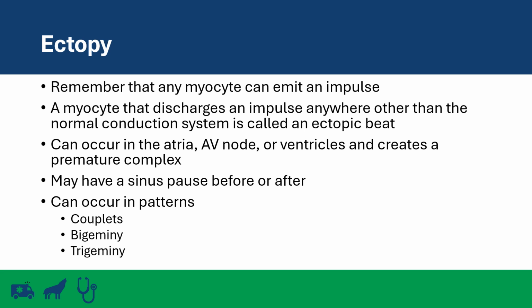Now, there may be a little pause in the baseline. You may have a sinus pause before or after this impulse. And these ectopic beats, they can come in patterns. We recognize a few common patterns like couplets, bigeminy, and trigeminy.